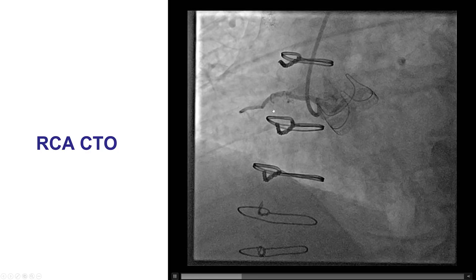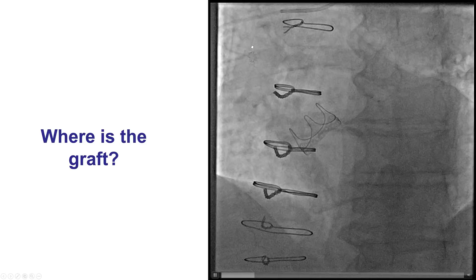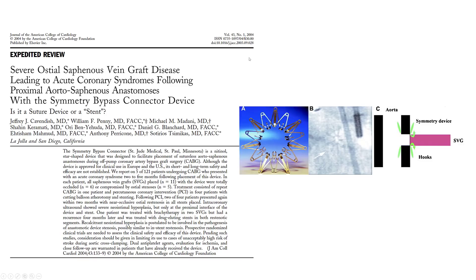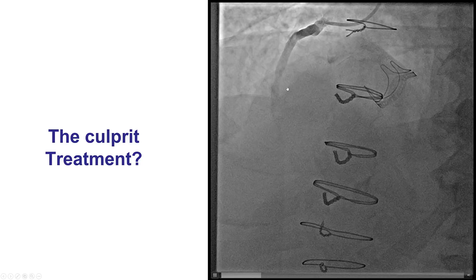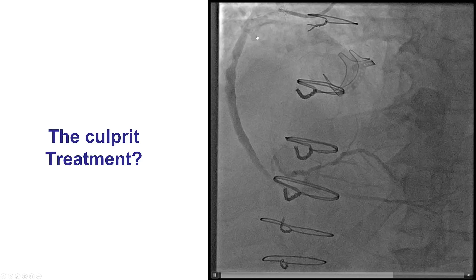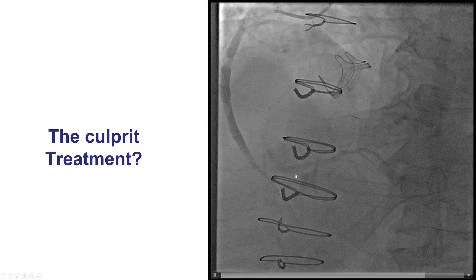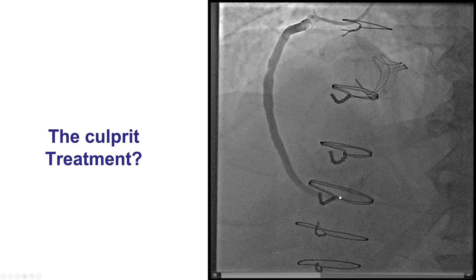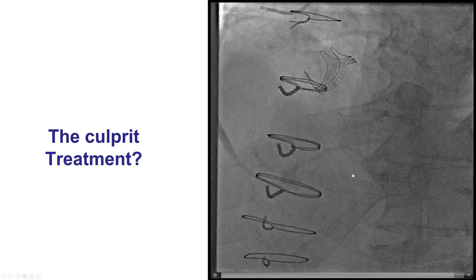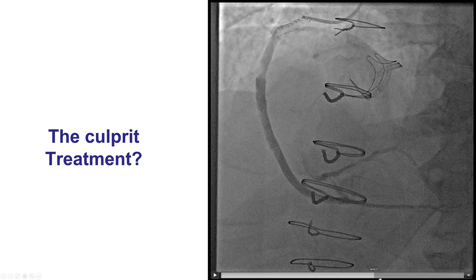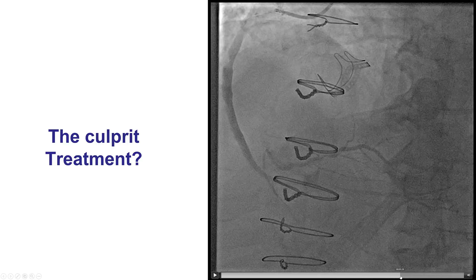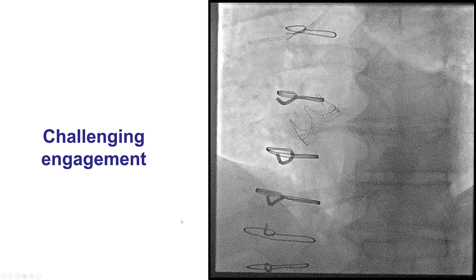Diagnostic angiography was done. The patient did have a right coronary artery CTO. He had a device which is actually a marker for the Symmetry device — a device formerly used for anastomosis of saphenous vein grafts in bypass, no longer used due to high risk of restenosis and reocclusion. It did serve as the marker of the origin of the vein graft. After selective injection, there appeared to be a severe 90% lesion in the PDA proximal to the touchdown of the saphenous vein graft. The vein graft supplies the PDA, the PDA supplies a large posterolateral vessel, but there is a significant 90% lesion right at the origin of the left posterior descending artery — that was our target vessel.